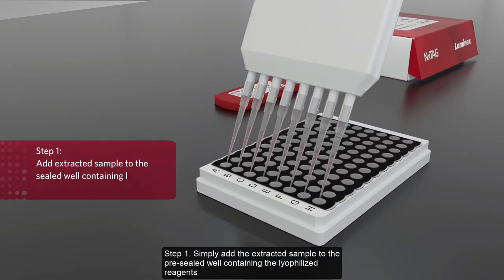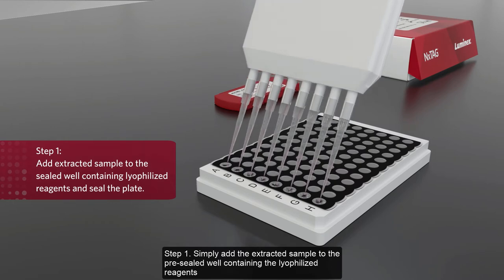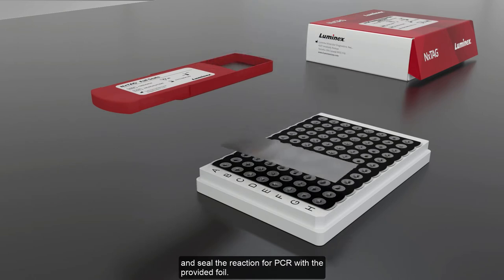Step 1: Simply add the extracted sample to the pre-sealed well containing the lyophilized reagents and seal the reaction for PCR with the provided foil.